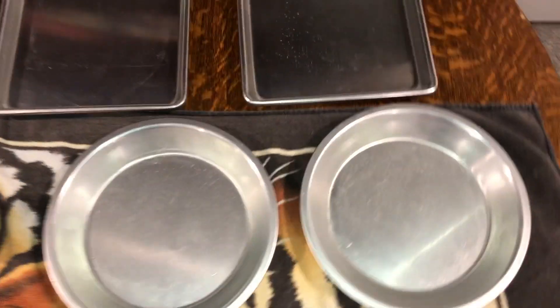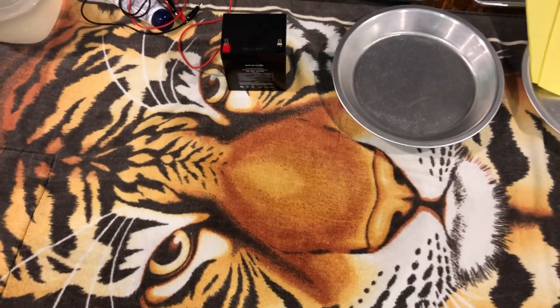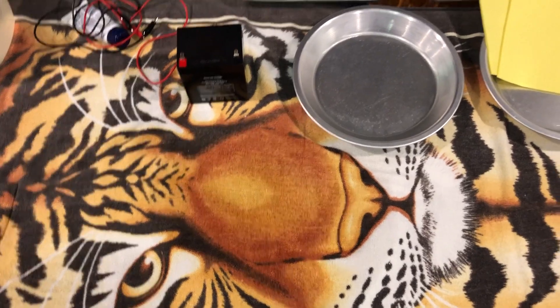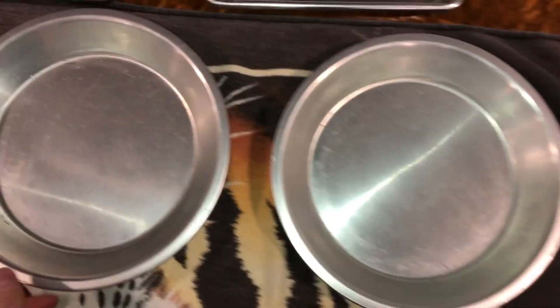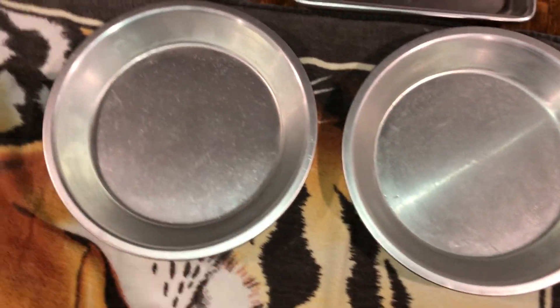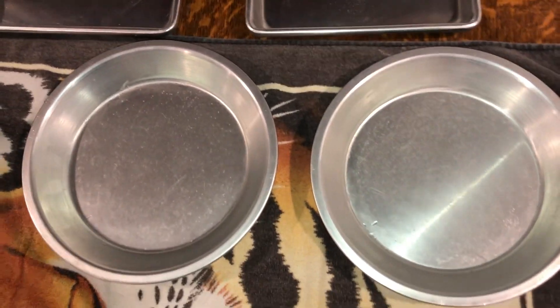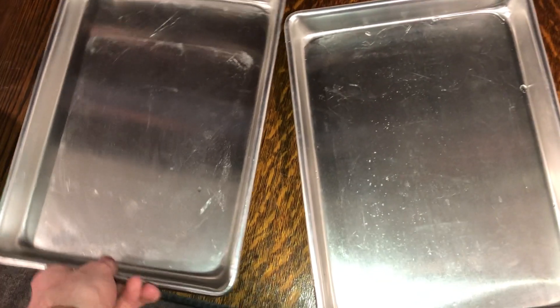I'm gonna get right to it and show you how to make your iontophoresis kit for hyperhidrosis. I'll show you everything you need first, then take you through step by step. You're gonna need two aluminum pans — these are just pie pans, anything that will conduct electricity. These two aluminum baking sheets or trays work really well for your feet.